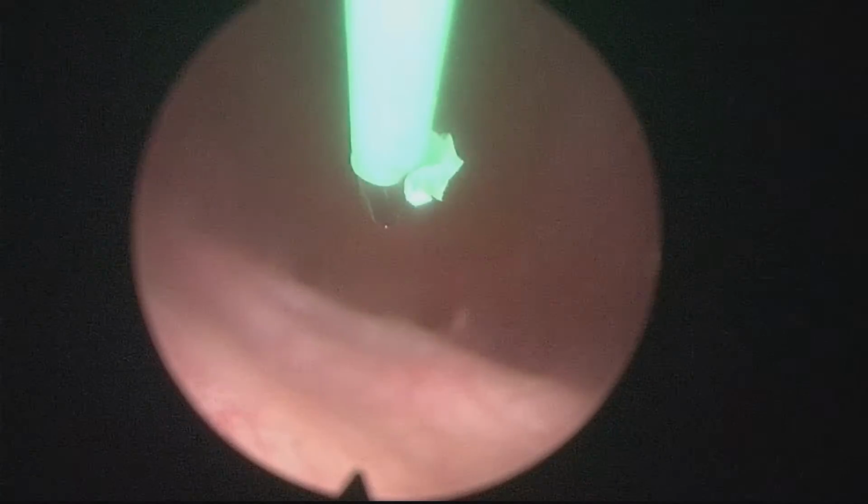So here, that is the UO, so we are quite far. You can see that the surface is a little bit rough. It's not as uniform as we are used to see, but as I say, this is possibly due to the post-operative inflammation after TURP and later fibrotic processes, and that's why we see these dilated glands and sticky parts where developing the plane is a little bit more difficult.